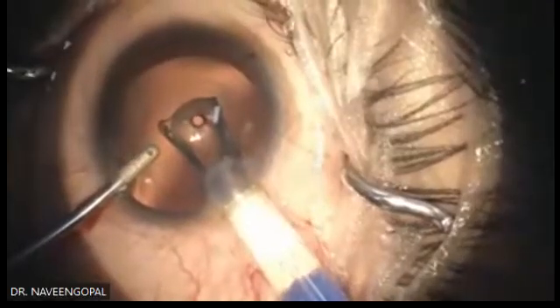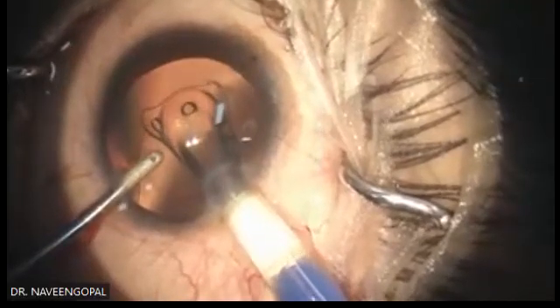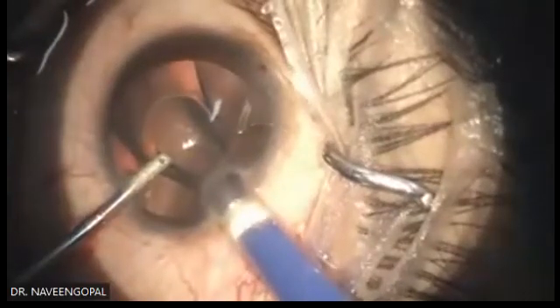This is the crucial part. If it opens on the other side, you can always withdraw now. Now I am putting it slowly. You can see the leading haptic having the hole towards the left side. I put the leading haptics directly inside the iris.